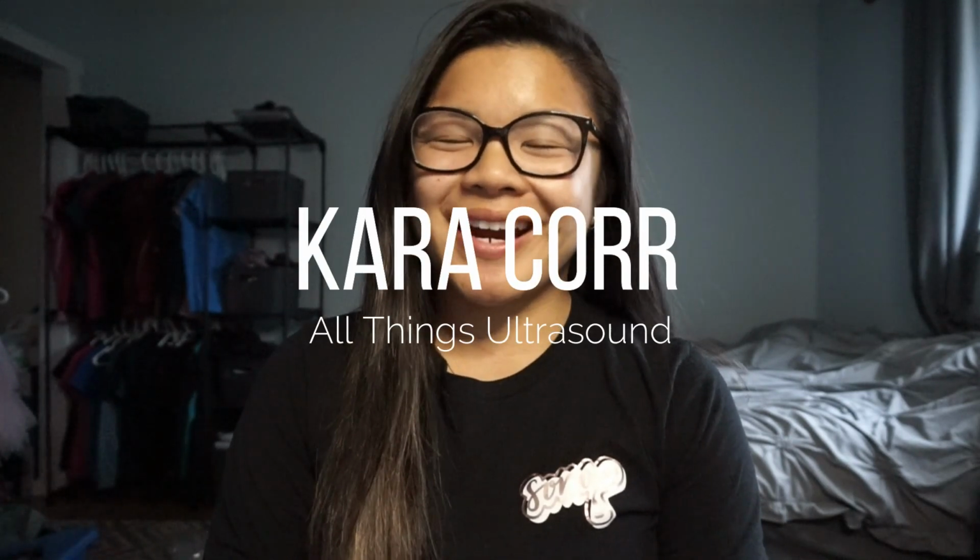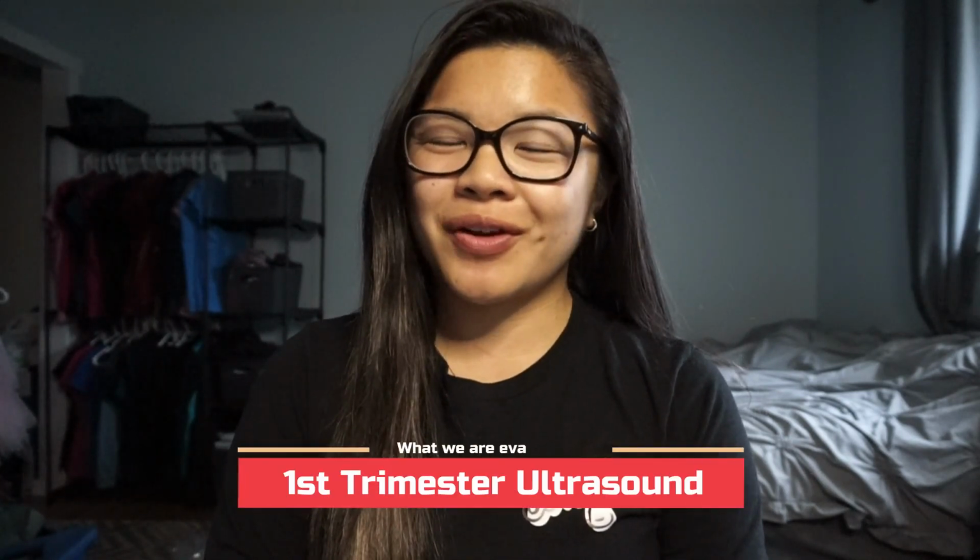I'm an ultrasound tech, and let's talk today about what we look for in a first trimester scan. First thing is we are looking to make sure that the pregnancy is actually inside the uterus. So, we want to make sure that the gestational sac is seen within the uterus and it is not implanted too low in the uterus. We also want to make sure that it is not a pregnancy that is outside the uterus, which would be an ectopic pregnancy.